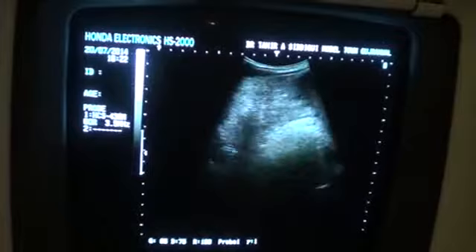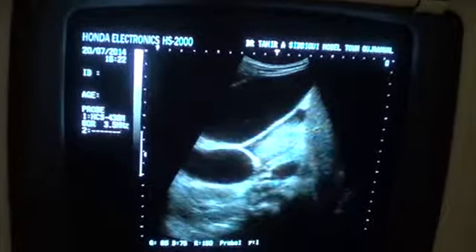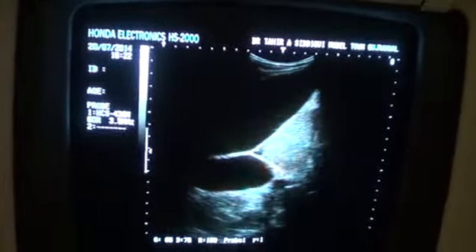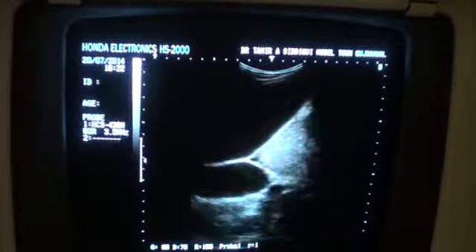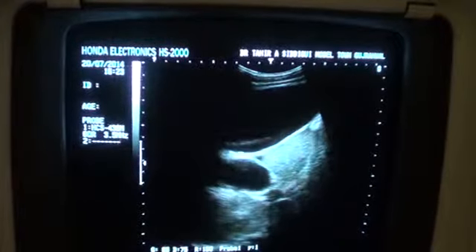And this is a case of obstructive jaundice as well, most probably because of some aggressive pathology which is beyond the scope of this ultrasound, especially when you are performing it with 2D ultrasound, not with a Doppler, and do not have the facility of a Doppler.